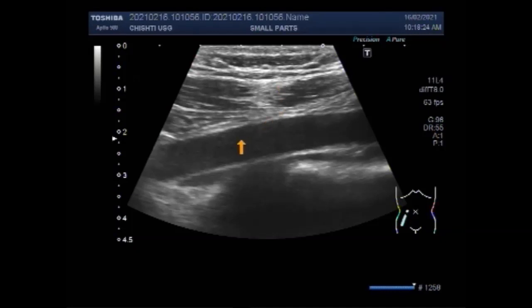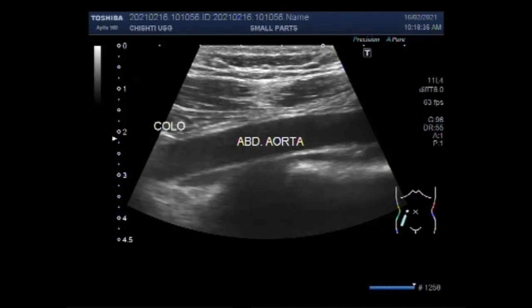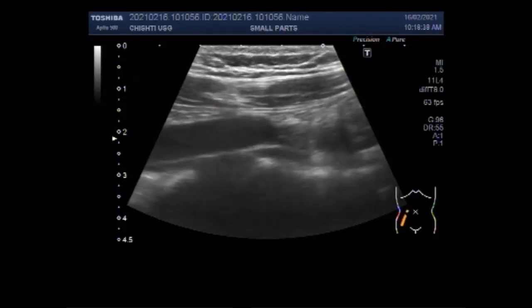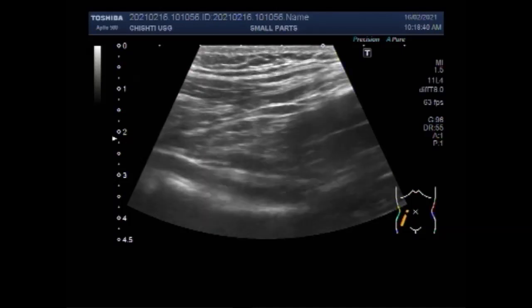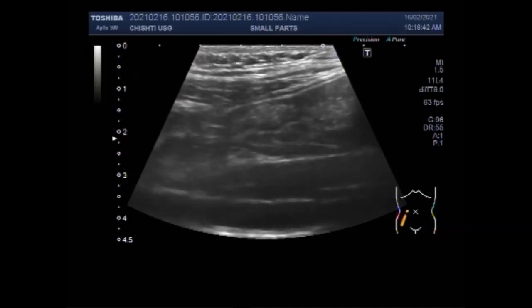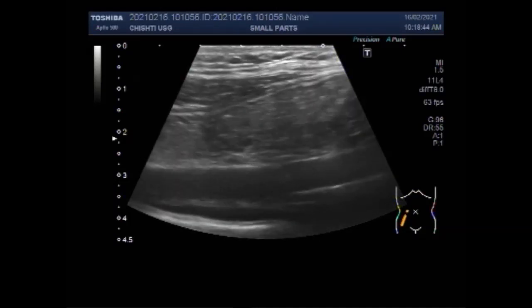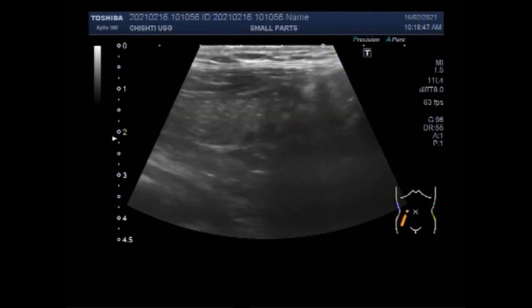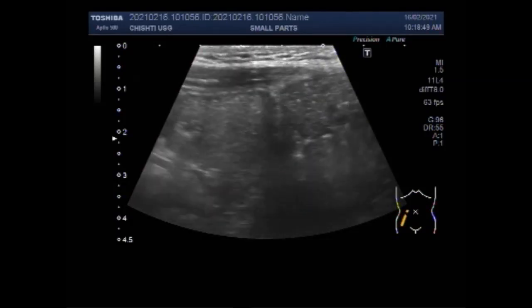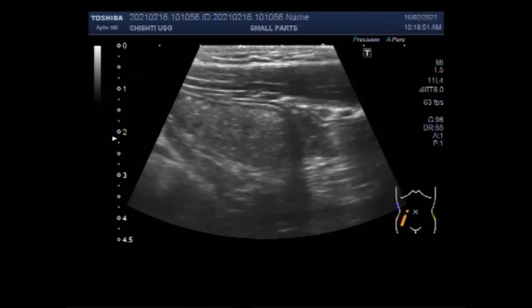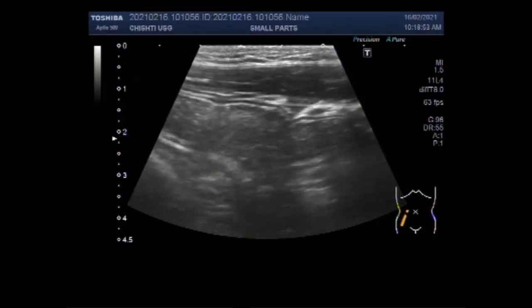This is a case where the patient is experiencing pain in the right pelvic fossa. When acute appendicitis is suspected, scan the patient lying supine. I selected a high-frequency transducer, from 7 to 11 megahertz. You may put a pillow under both knees to have the abdomen of the patient relaxed.